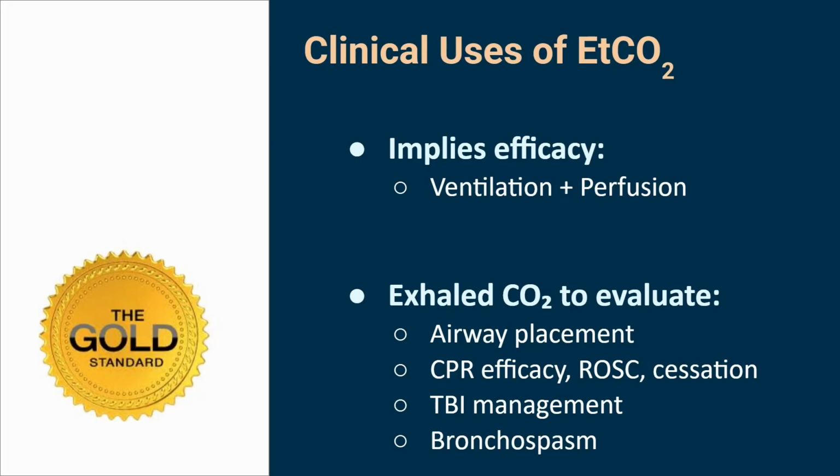But the point is this: if you put somebody in cardiac arrest on end tidal and they're hovering around 20 millimeters of mercury, and you notice it's 18 and 16 and 15 and it's just staying low, the answer to the question is verify your compressions. Why would poor compression lead to hypocapnia? Or you tell me. Low perfusion, right? I'm not squeezing the blood around, not moving it, so it can't get to the lungs and it can't get ventilated.